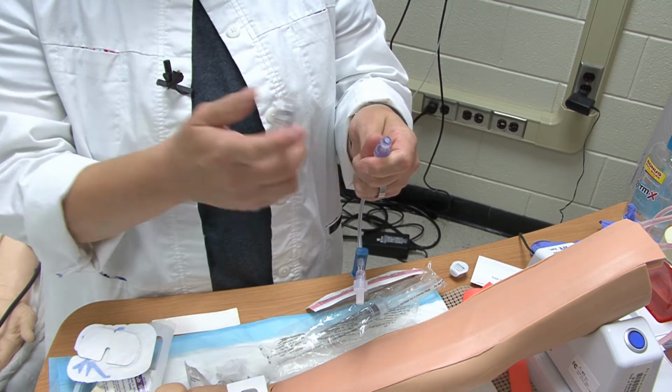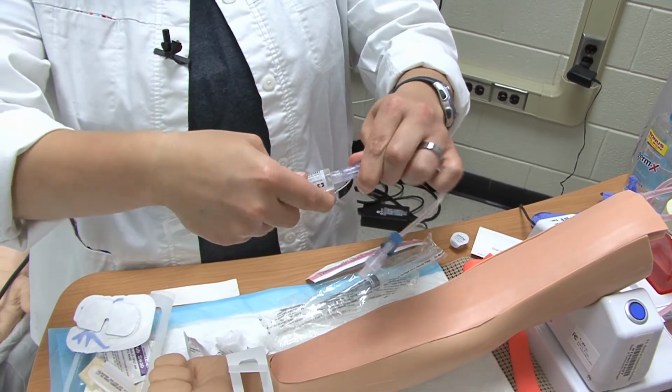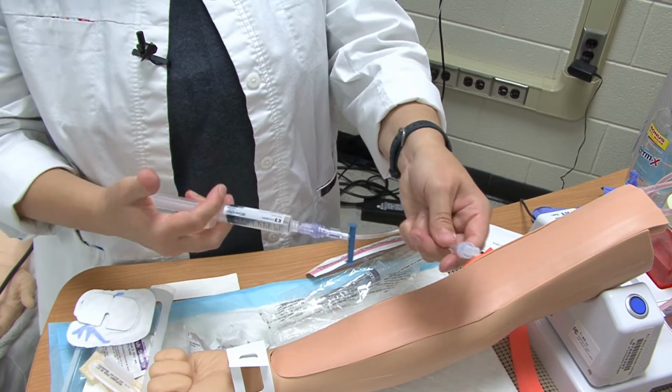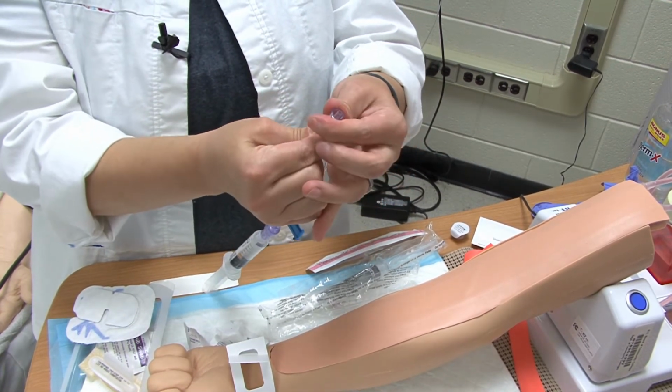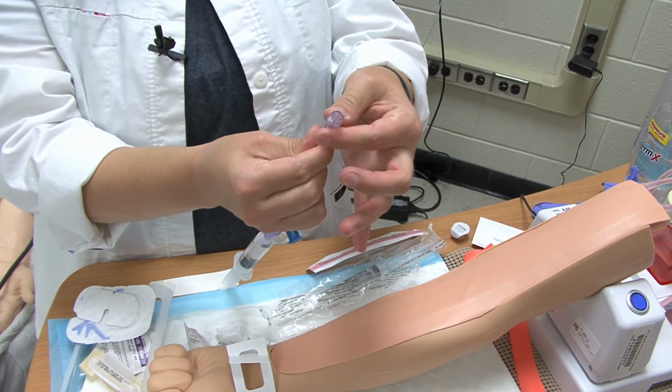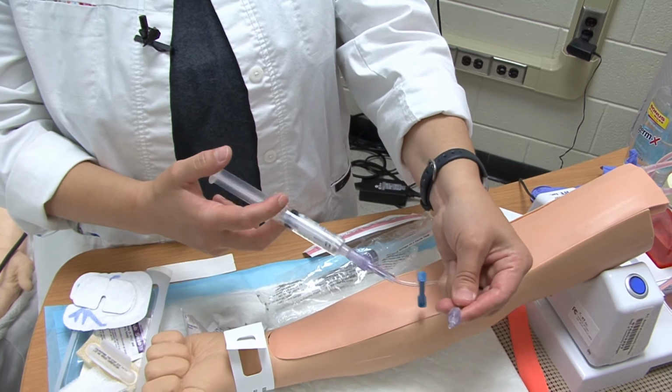I have not touched this again in between the cleaning, so I'm going to go ahead and it's twist to the right. And then I'm going to go ahead and flush this. Now, whenever you flush it, if you take the cap off, you need to pull this piece back and just kind of loosen it up a little bit. And make sure when you flush it that you flush all the way to the end.